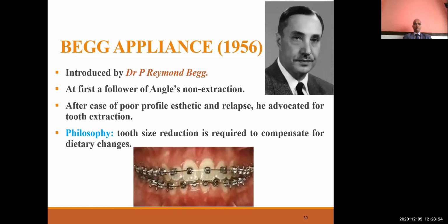Next appliance is Begg's appliance, which was given by P. Raymond Begg. At first, Begg was a follower of Angle's non-extraction philosophy. When he looked at a case of poor profile aesthetics and relapse, he advocated for tooth extraction.